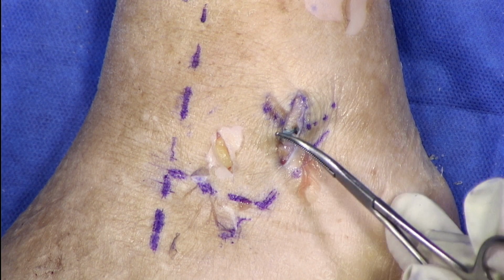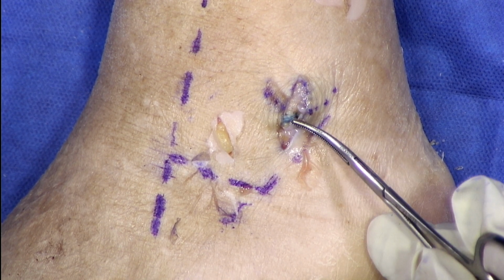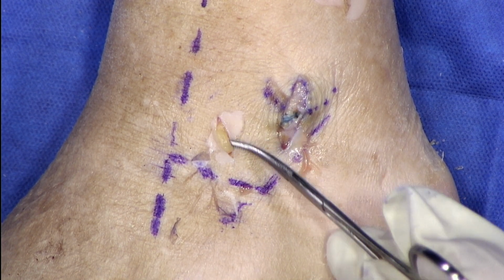Initially, what I was doing with most of my Broströms was just a simple modified Broström, just using simple sutures to repair the ATFL. The problem with that kind of approach was the patient was being put non-weight bearing for a few weeks, then weight bearing is tolerated in a cam walker boot, and then progressing to physical therapy. And now with the advent of internal brace, I've been able to push my patients much more after the surgery.